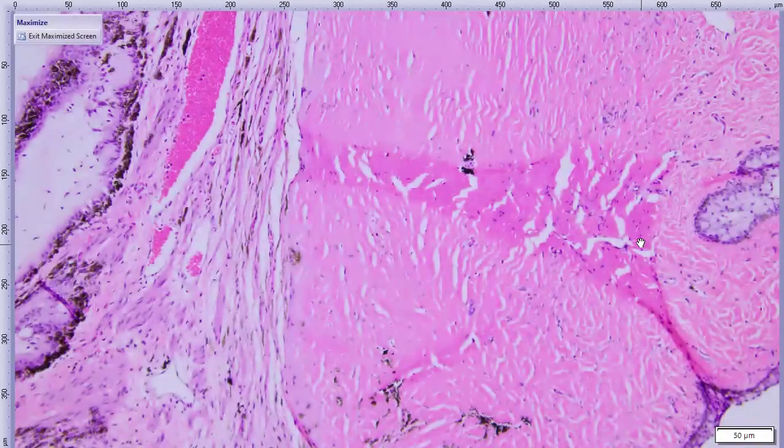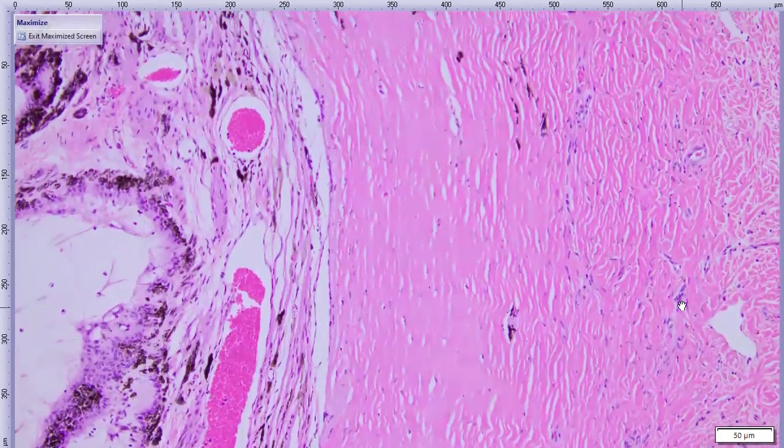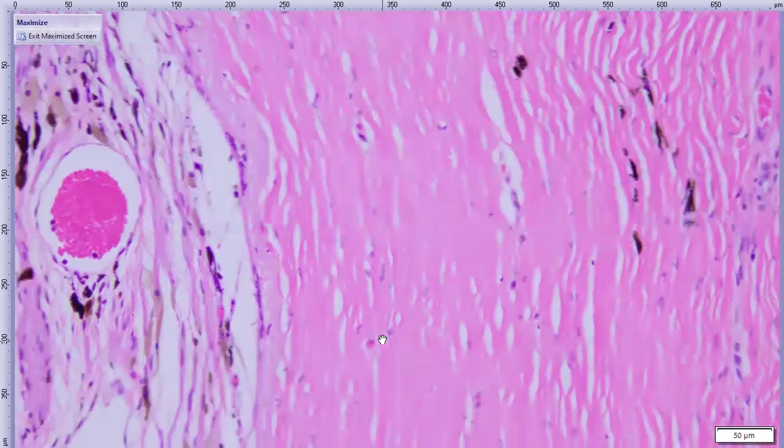So maybe you would believe me if I said that the deep stroma here kind of looks like maybe cornea. The collagen fibers are in parallel organization here, so we might be at limbus or so with the deep corneal stroma still in existence. And if we look along that too, there's this really wrinkled and folded up basement membrane. So there is still Descemet's membrane at this level too. But even this area is kind of abnormal. It's vascularized.